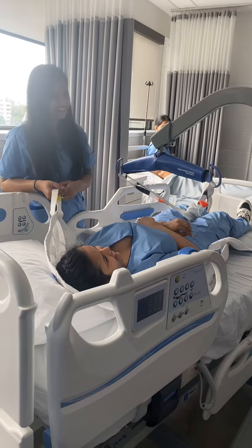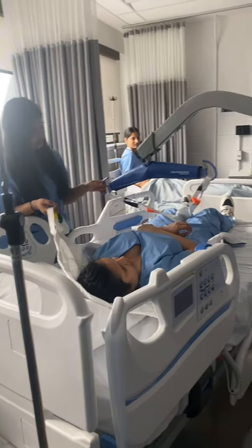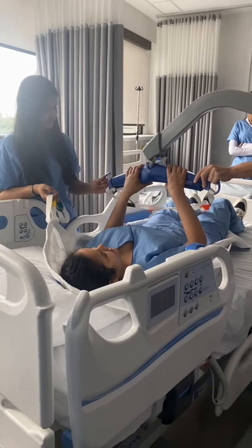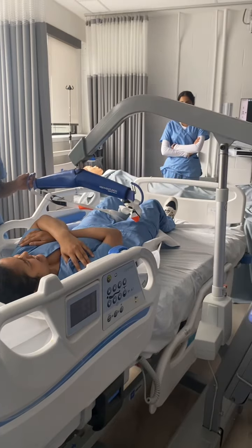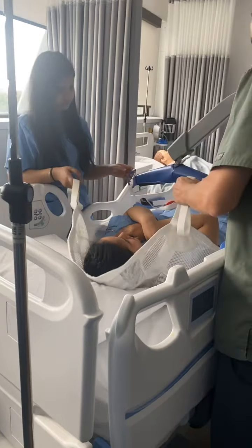If you can't reach it, you've got to move this over a little bit. Okay, good. This is as far over as it goes. Put it a little bit lower. You cross your arms, please. So you put it as low as you have to reach for the shortest.